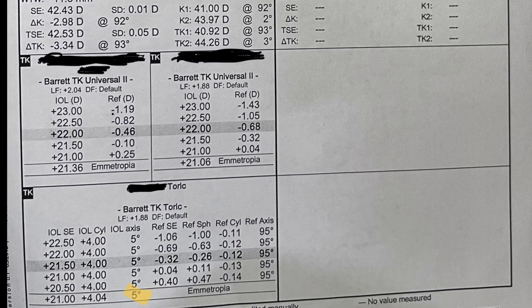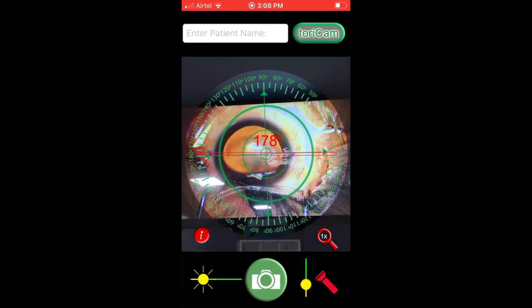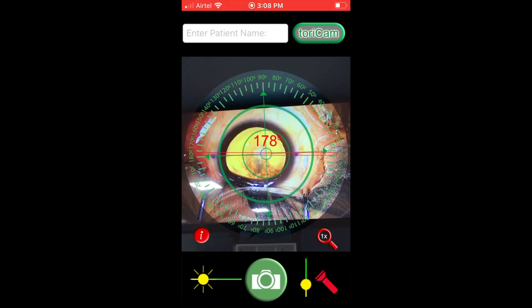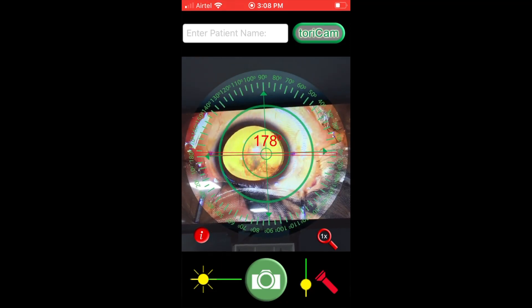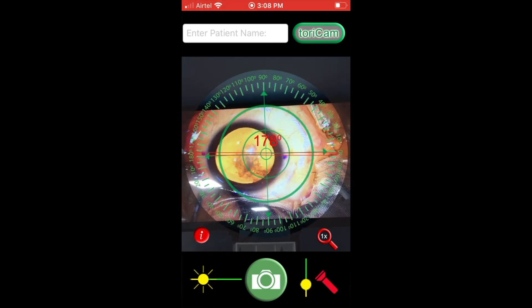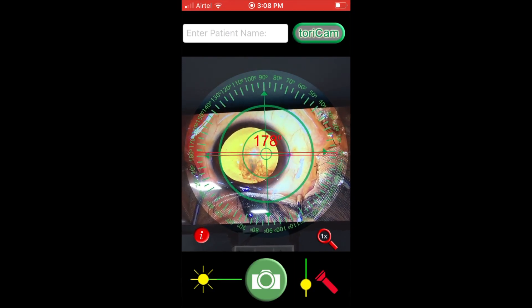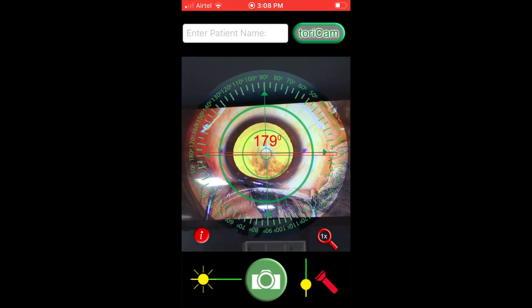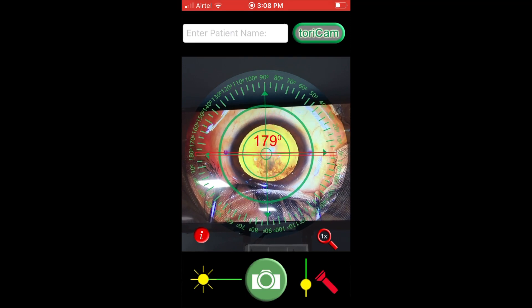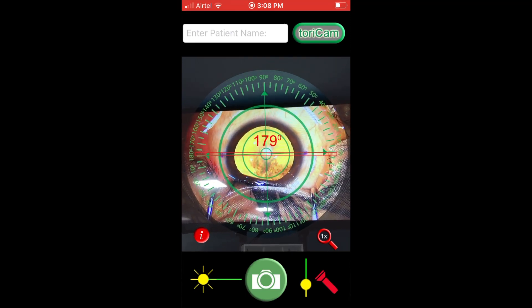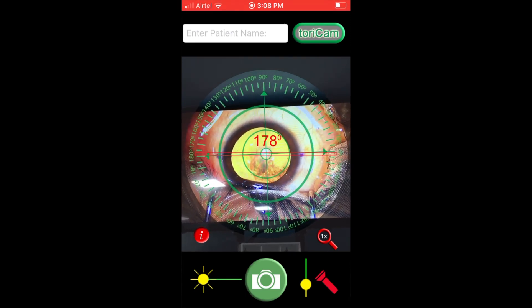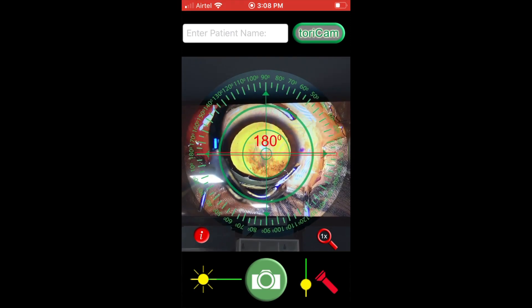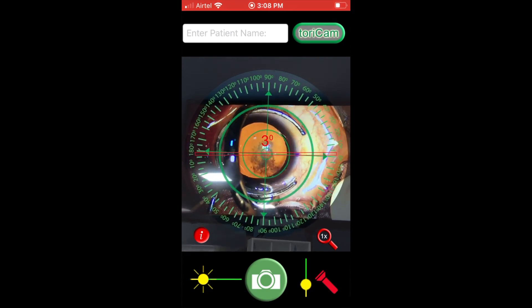This patient's TORIC IOL axis is at 5°. The first step is to open the toriCam app after draping the patient, focus the app on the live surgical display inside the operation theater, and ask your assistant to align the app to the 0-180 degree mark.